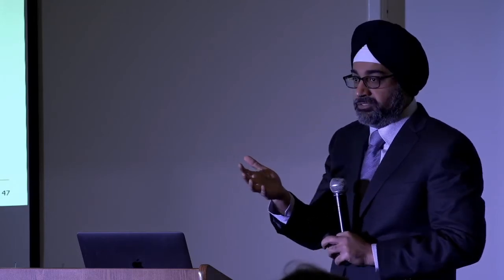So of course patients are going to be bummed that they got randomized to just medications. They went through all of that for nothing. However, one of the good things about this trial is that at the end of 1 year, if you've undergone a year, you can get the device at that time. So it is medical therapy, but it's just for 1 year, and after that you can treat them with the clip and see how they do.